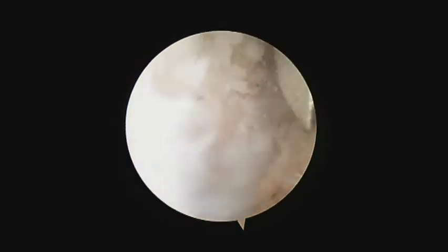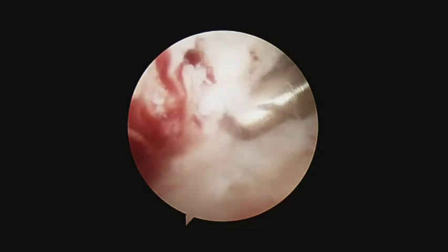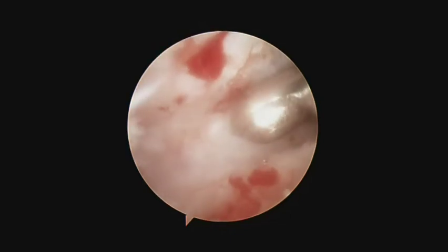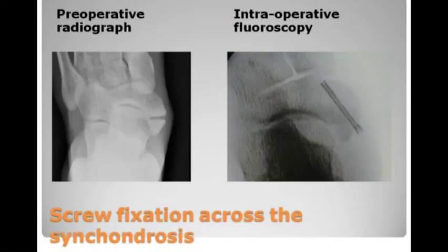Finally, the foot is inverted and plantar flexed, and the synchondrosis is compressed by a percutaneous screw.